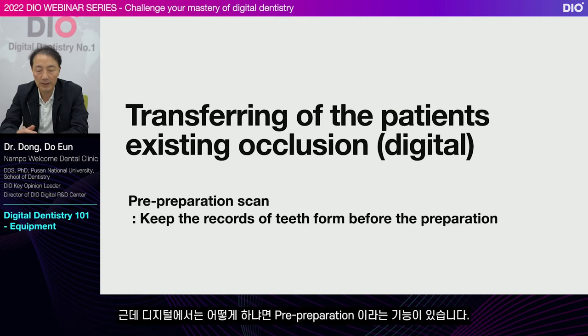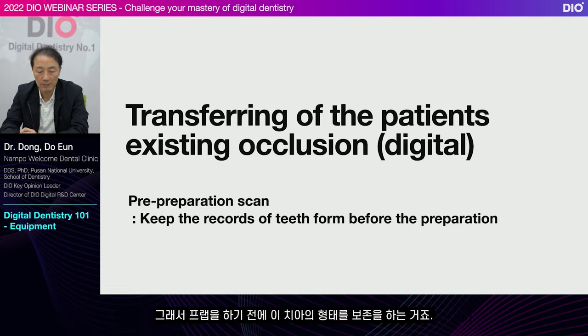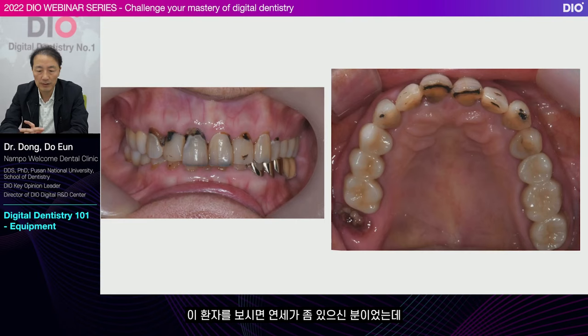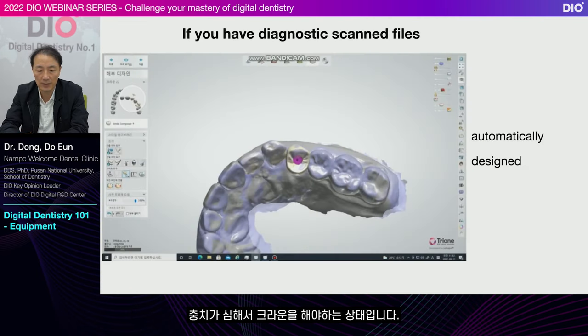But in the digital method, there is this function called pre-preparation. It allows you to conserve the shape of the original dentition before prepping. Let me show you a case. So, this patient was pretty senior. I wanted to maintain the canine guidance while prepping the tooth. There was severe tooth decay, so it required a crown.